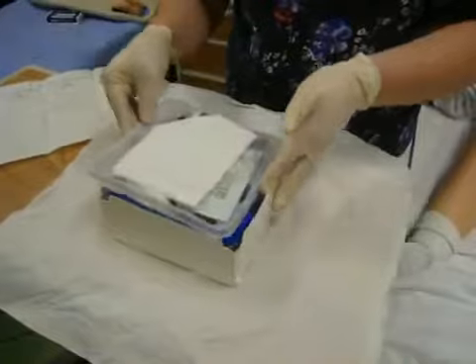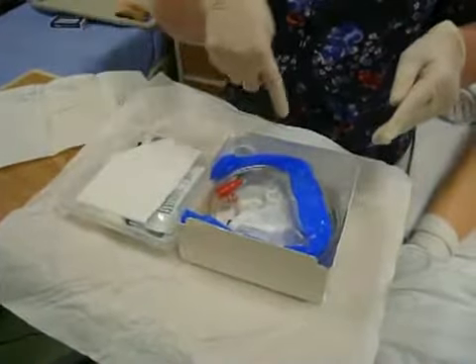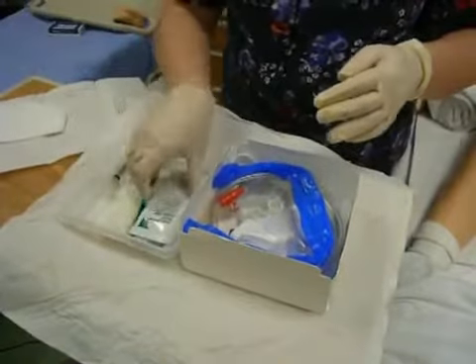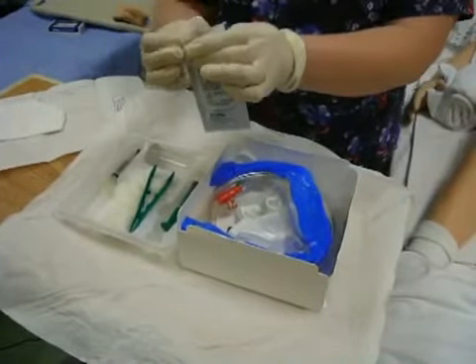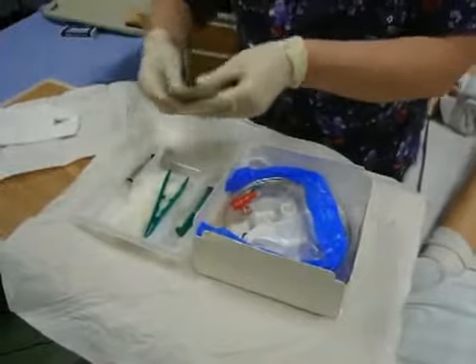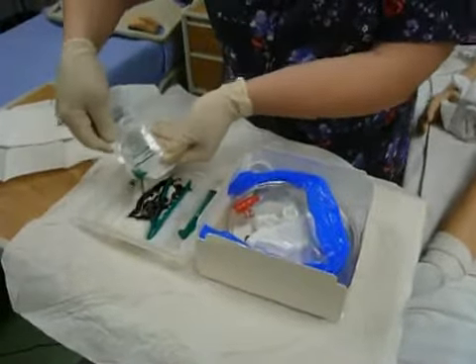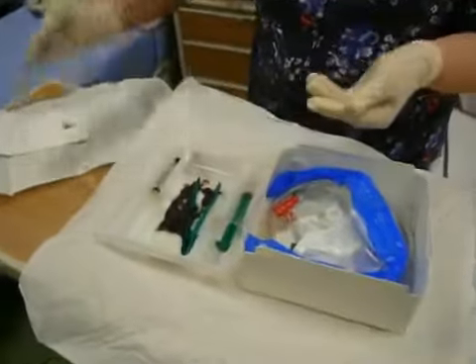What I'm going to do is separate these two. Remember, there's a 1-inch border, so as long as I stay within that, I'm fine. Fenestrated drape, I don't need. I'm going to open up my iodine by tearing it down like this. You'll notice in the female cath video I did not do that. That was to save supplies. This one I'm actually going to do it so that you can see it. It's liquid, so be careful. Soak all the cotton balls.